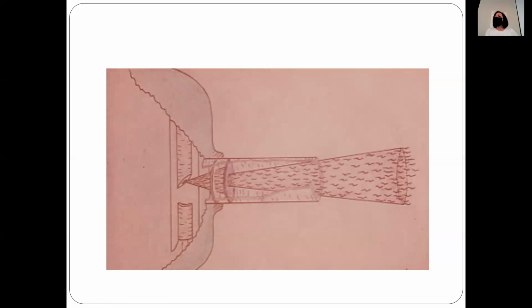Here's another image of the X-rays coming off of the anode. They're going through the aluminum filter, and then through the lead collimator. You can see how it restricts the size, and the longer BID helps keep this divergence from being too broad too soon, because you can see how it spreads out pretty fast. It's going to do that anyway, but the longer BID helps to control that.